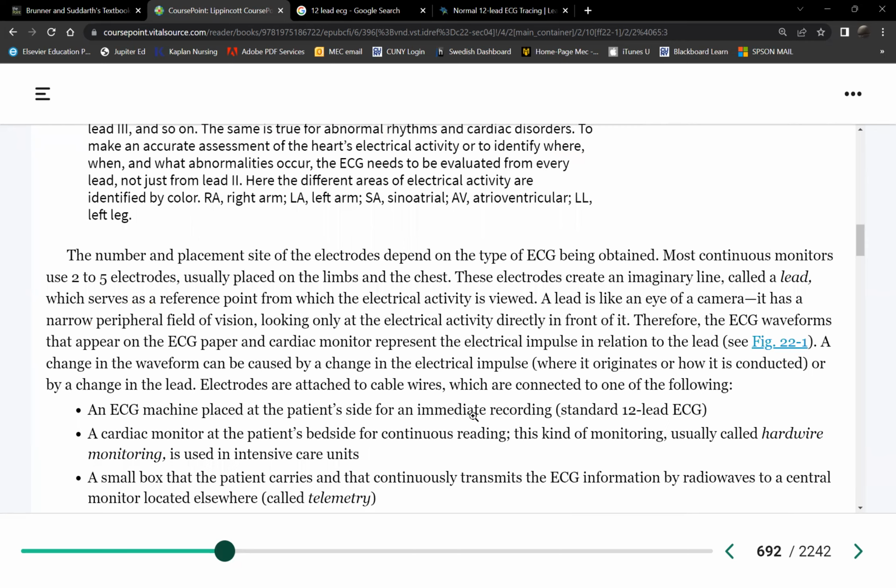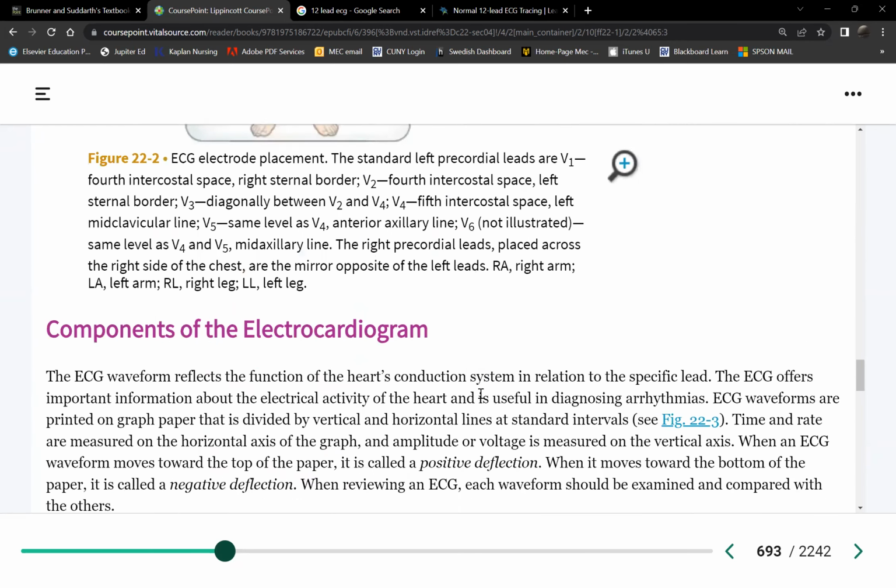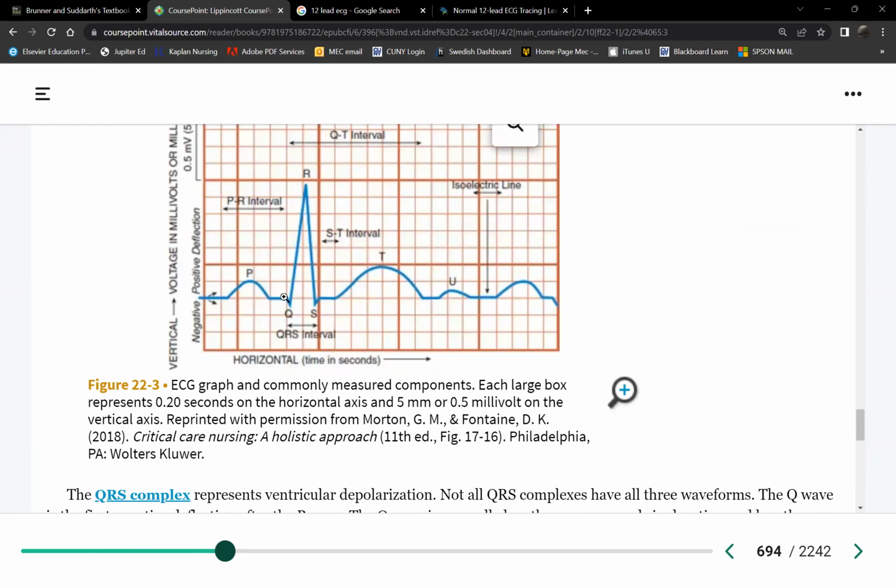Will our rhythm look like this? Will it look like this? Or will it look like after the P, there will be a Q right away? Correct, that would have been it. So is it going to result in normal cardiac output, in normal blood flow through the heart? No. If there is no PR interval, that means both the atria and the ventricles will contract at exactly the same time. Would you agree?